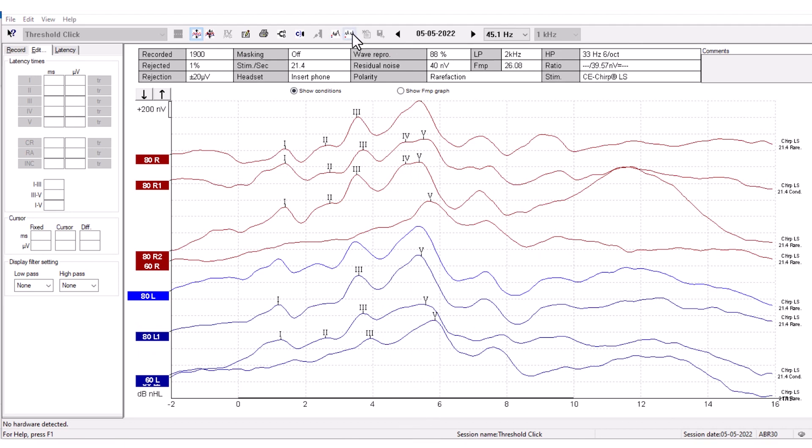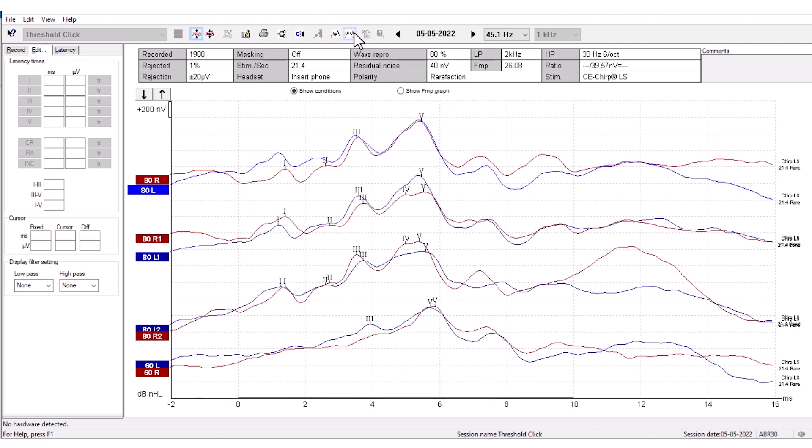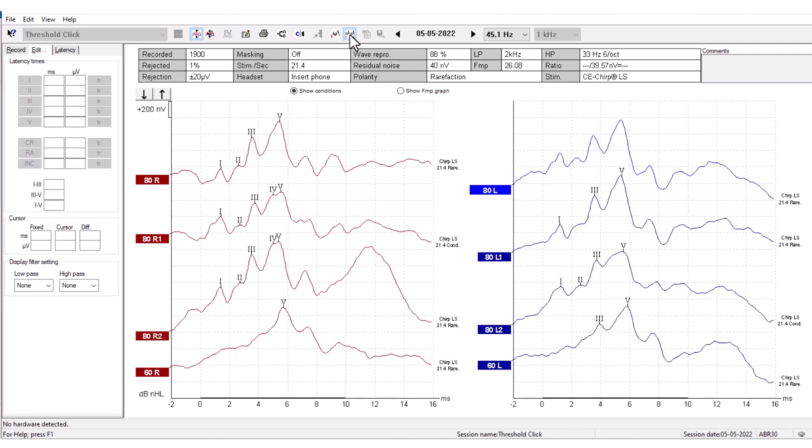This is the Split Screen function that will split the display to show the right and left ears. When pressed, you have the right ear ABR and the left ear ABR here. When you press it again, you stack the ABR measurements. Click the button again to split the display to show the right and left ears.